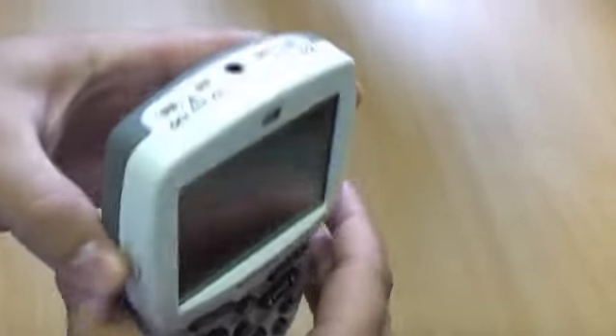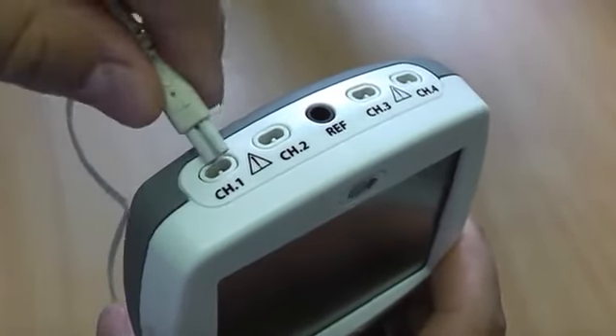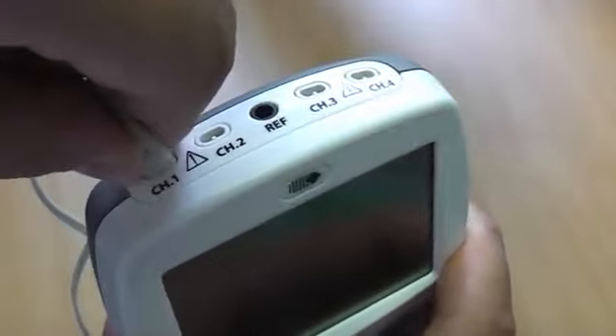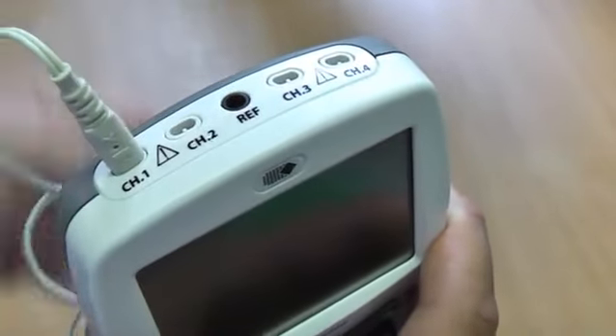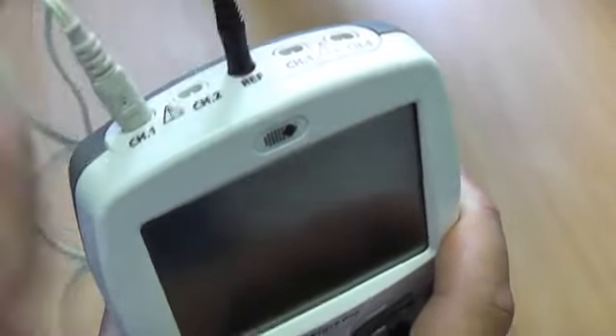You need to connect your lead wires to the sockets on the top of the unit and at the other end to the correct site on the muscle. For EMG it is necessary to connect the EMG reference lead wire to a separate electrode placed anywhere on your body, but preferably on the same limb.